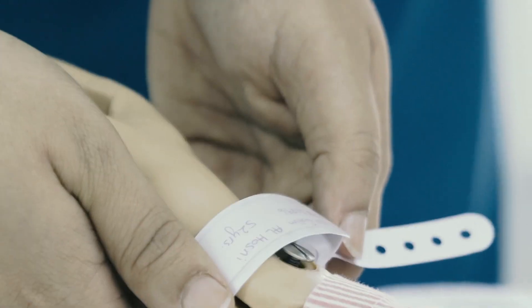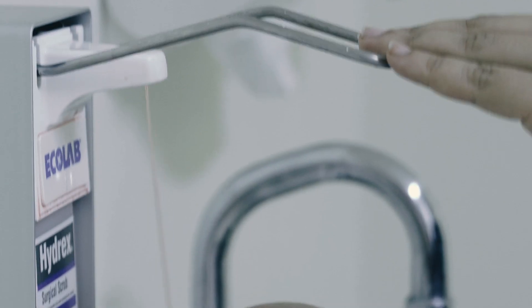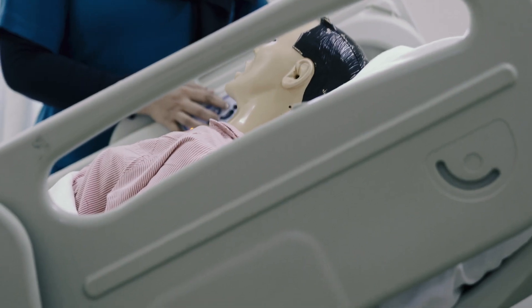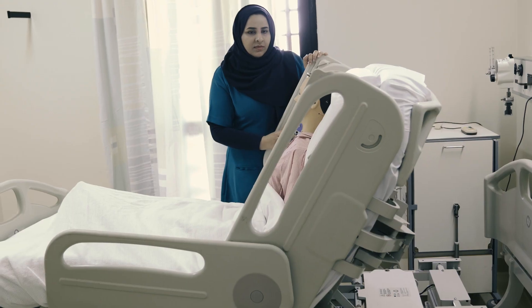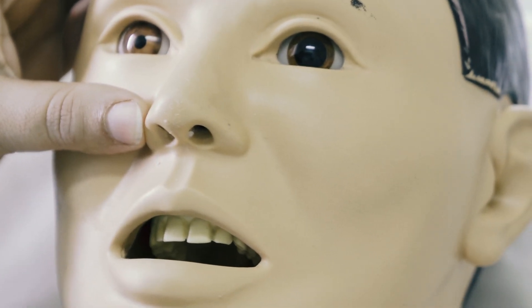The nurse will identify the patient and explain the procedure to the patient or to the relative. Wash hands before the procedure and position the patient in an upright position. Assess which nostril will be used for the insertion.